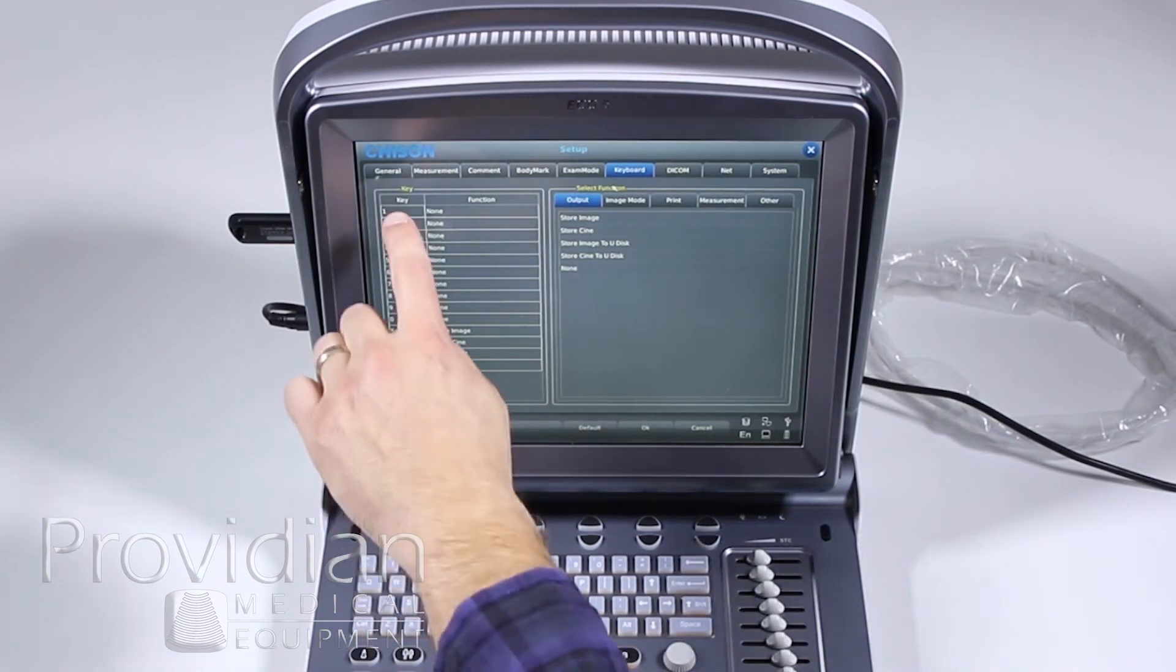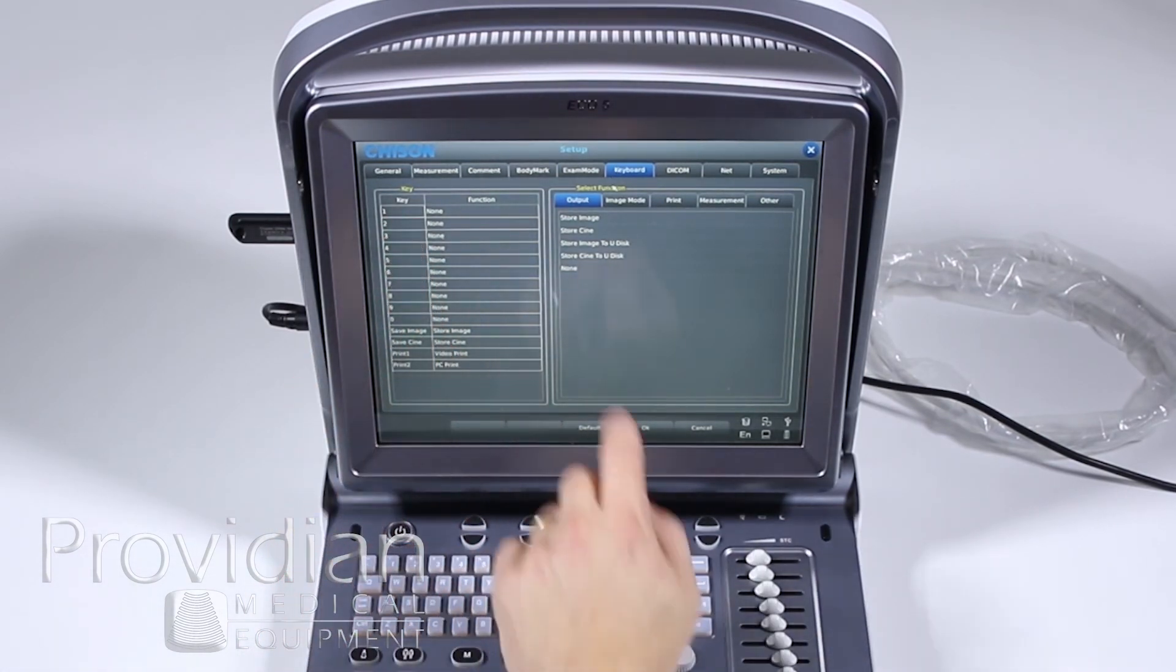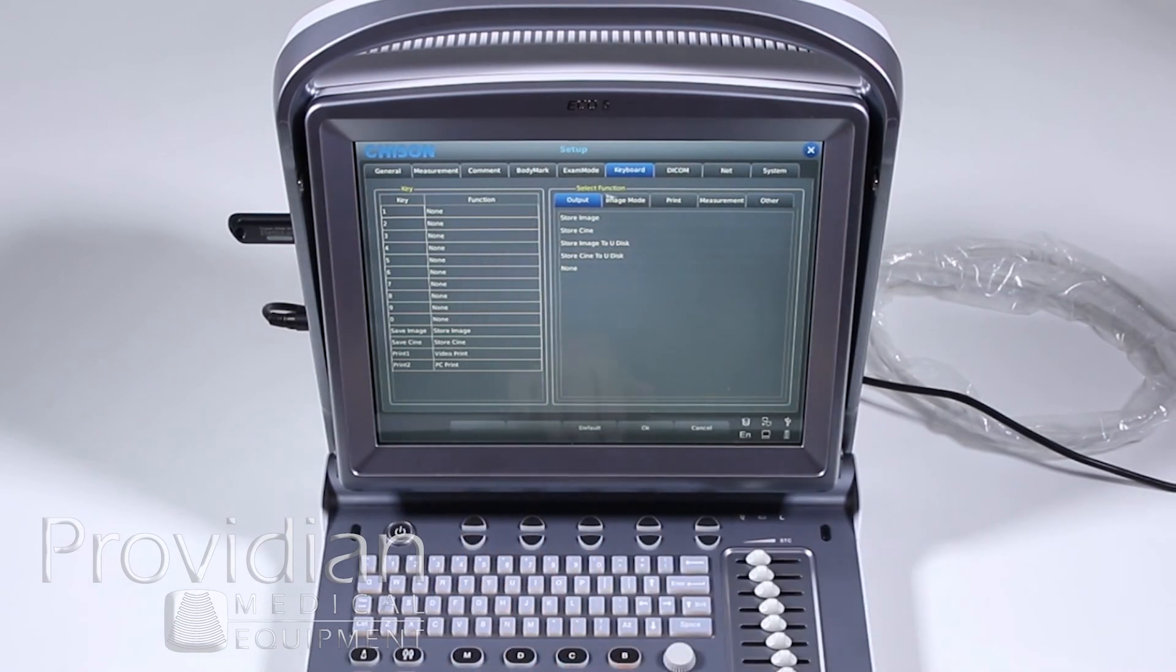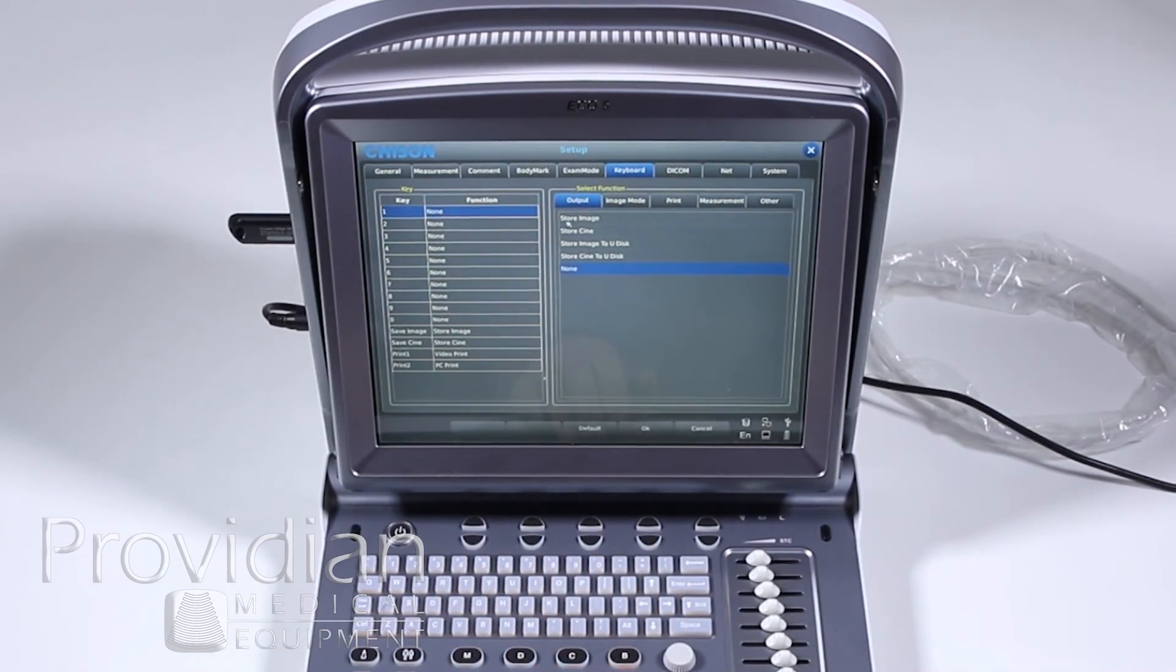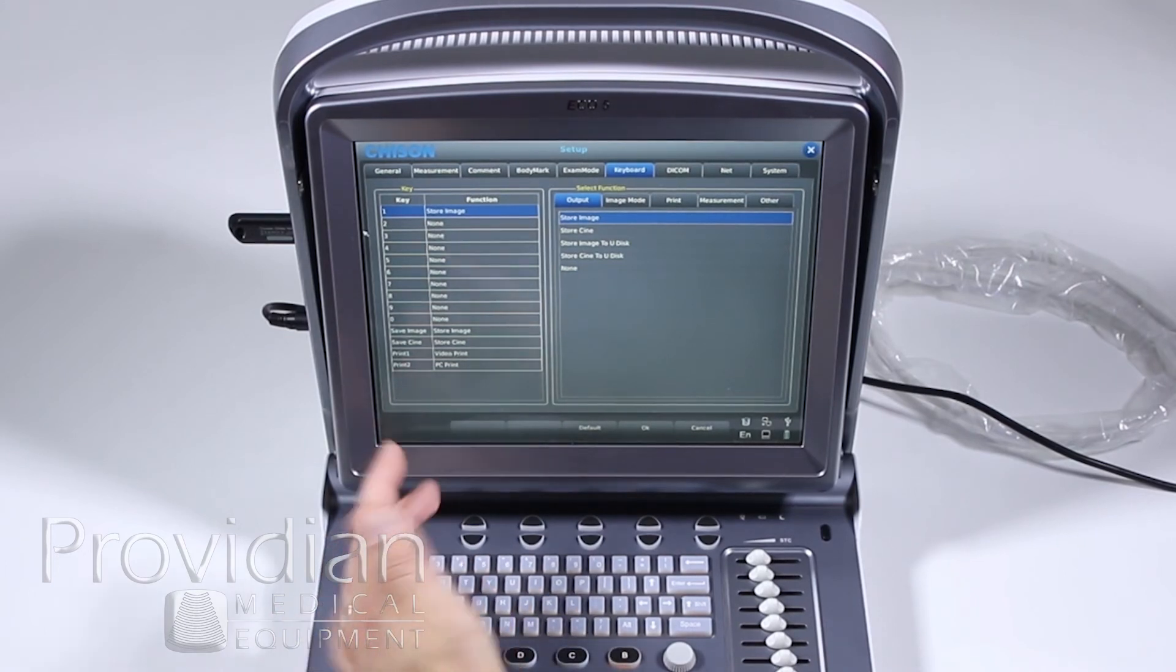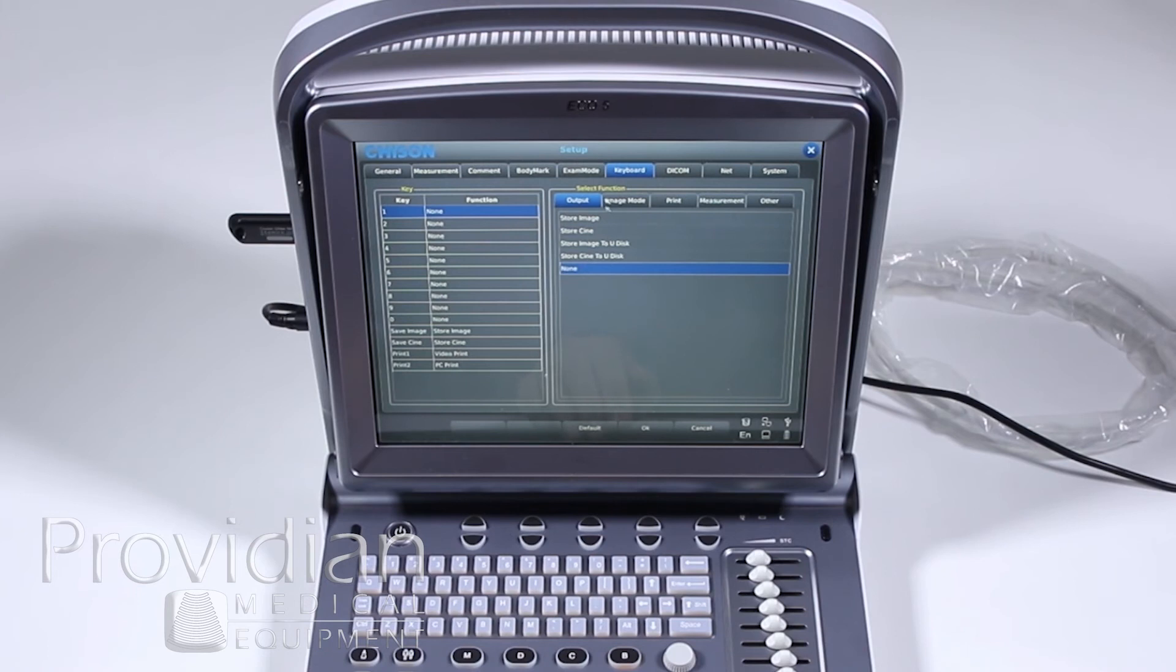Keyboard configuration. These numbers one through zero can be configured to anything, any function that's selected over here. So if I want to press the one key to store an image, I can select that and each time I hit one, it's going to store an image or I just select none. So I've got all these different things. I can have that saved to the U disk, et cetera.